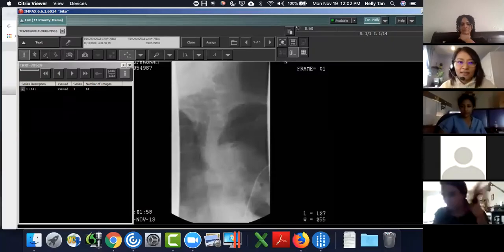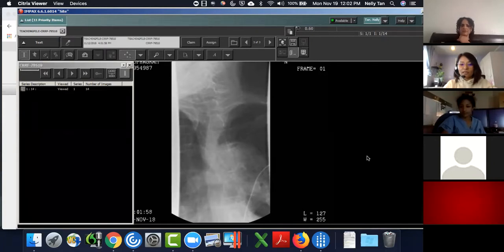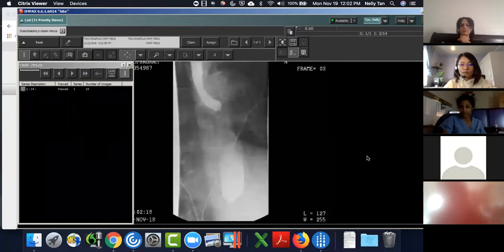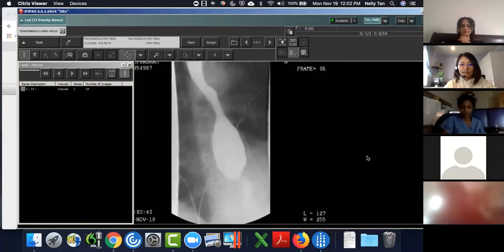Patient who presented with dysphagia. So I saw this patient for the first time. So we can go ahead and get, oh, it's recording, I think. So the patient presented with dysphagia. I was on service today, so that day, I did the upper GI.